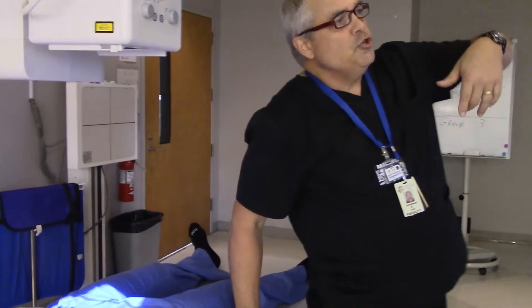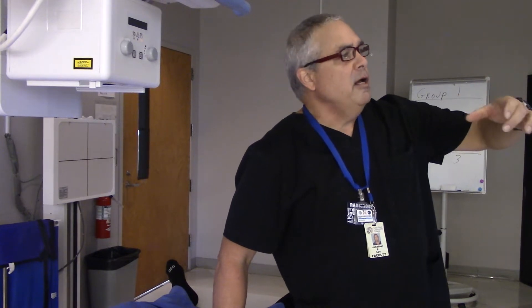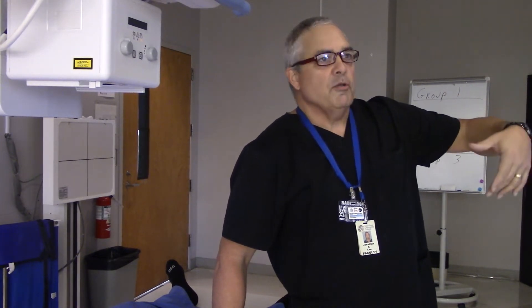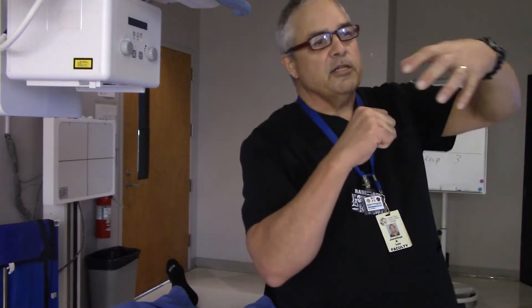Okay, what are we trying to shoot on this x-ray? What do we want to have on our picture? We are supposed to be looking at the patient's hip joint. Exactly — the patient's hip joint, the acetabulum, and including the proximal femur. The acetabulum is what the femoral head articulates in. Exactly — the acetabulum is that cup shape that the femoral head fits into.